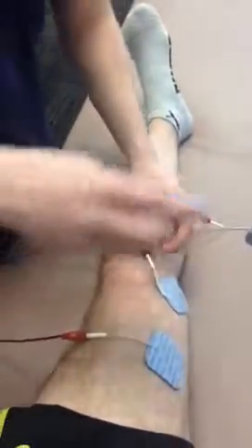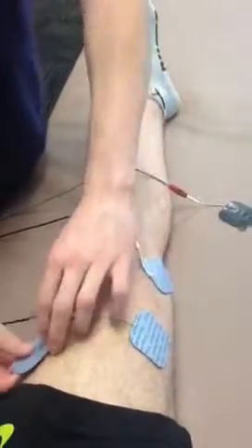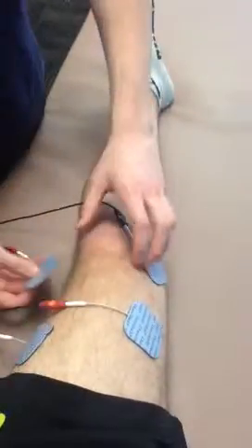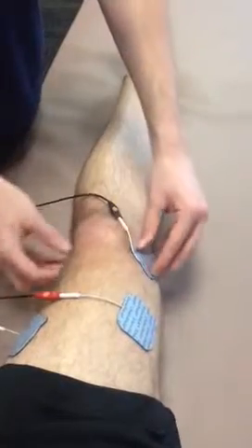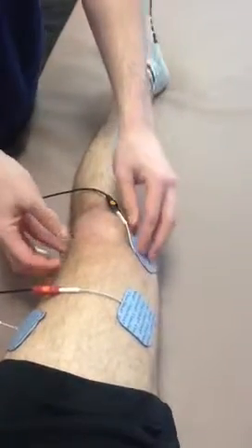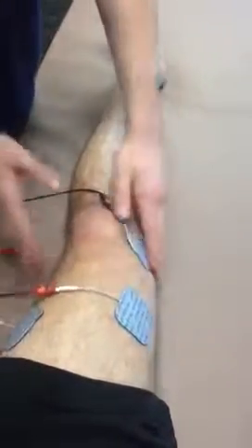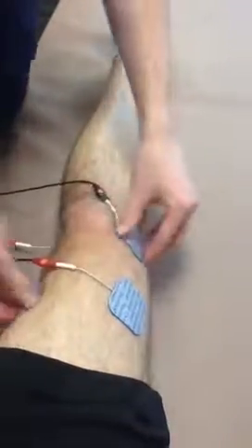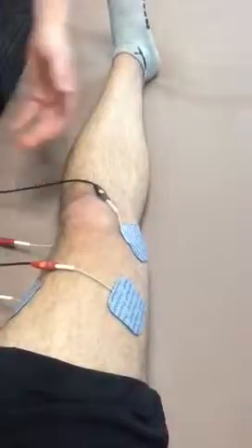And for interferential, you want to make sure that you create basically a treatment zone, most like an X. You want to make sure the black pads are across from the black pads and the red pads are across from the red pads. So this interferential could be used for a much larger treatment area than just a regular premod could be used. But it's essentially, just move that back down a little, keep it level. That's essentially the same thing. What you're doing with this is just creating a treatment area.